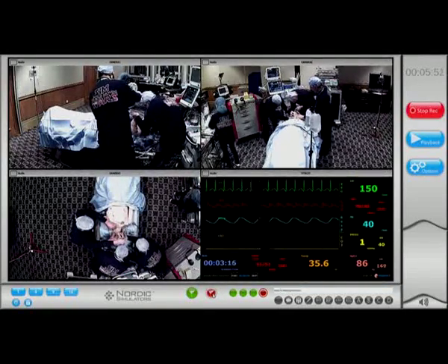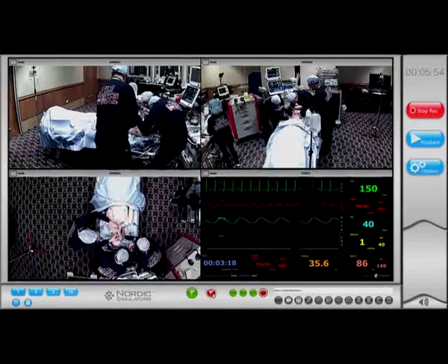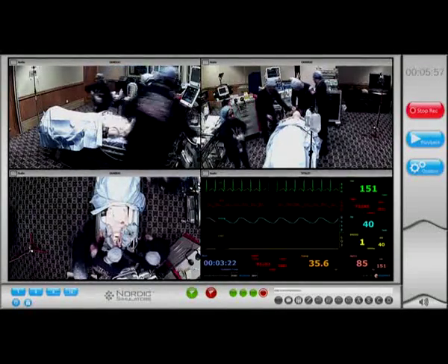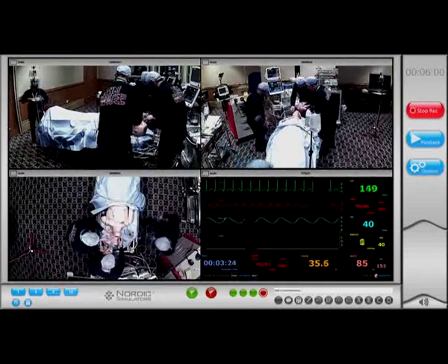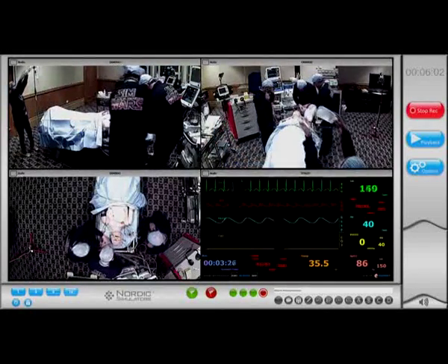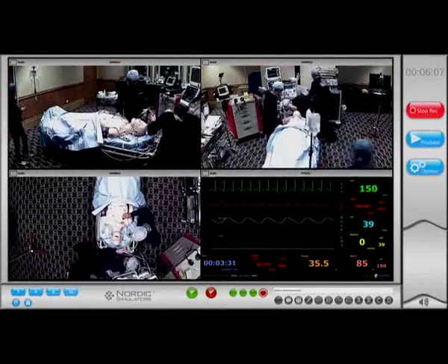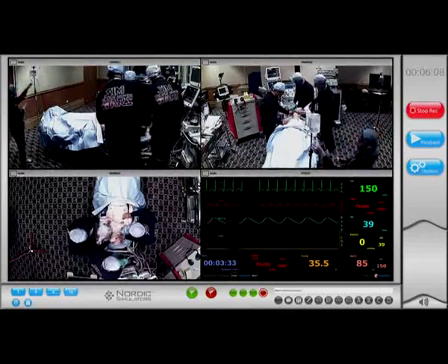Okay, give me the tube. Tube in, and stylet out. Connect. Inflated. Okay, sir. Okay, ambu bag. We are in the 21. Ambu bag. Ventilate. Do you want the ambu bag?